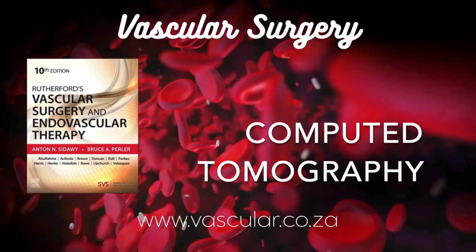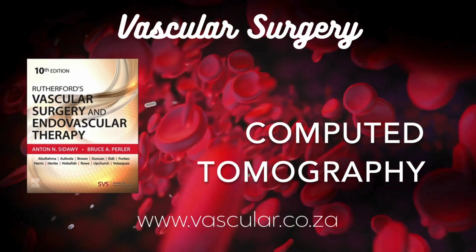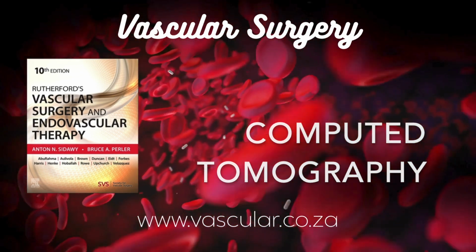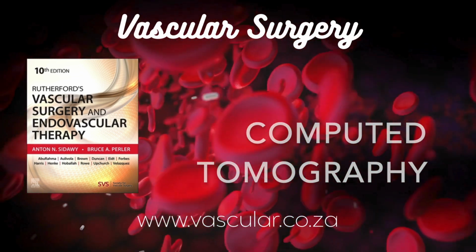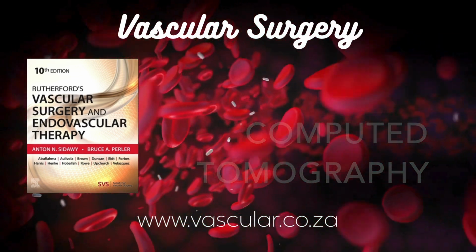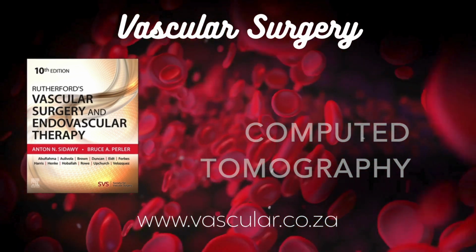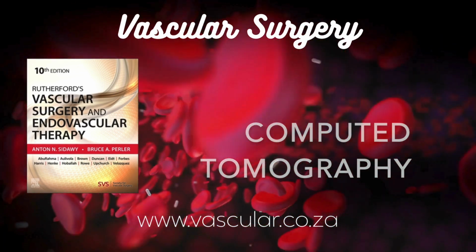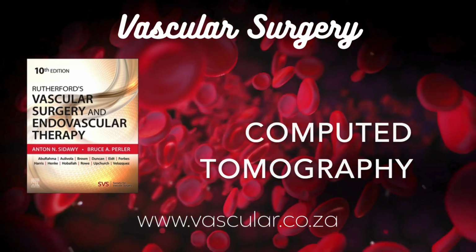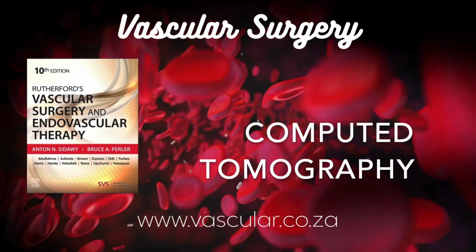Okay, fundamentals down. Now, obviously, scanners have evolved massively since the 70s. Take us through that evolution. Right, those first-gen scanners, the single-slice sequential ones, they could only scan one slice at a time. You'd scan, the table would move a bit, you'd scan again. Slow going? Very. And with that initial 160 by 160 matrix resolution, they were really only practical for things that didn't move much, like the head. Trying to scan the chest or abdomen? Forget it. Breathing, heartbeat, too much motion blur. Yeah, that makes sense.